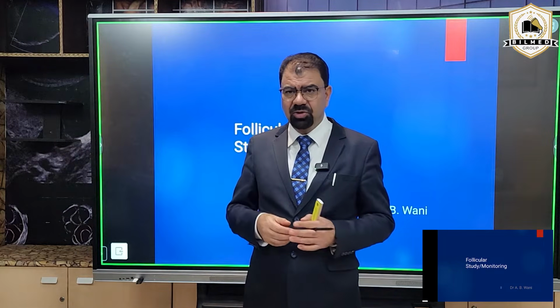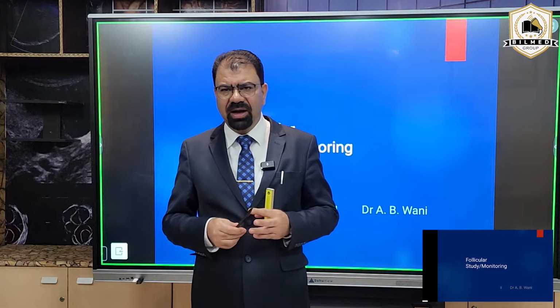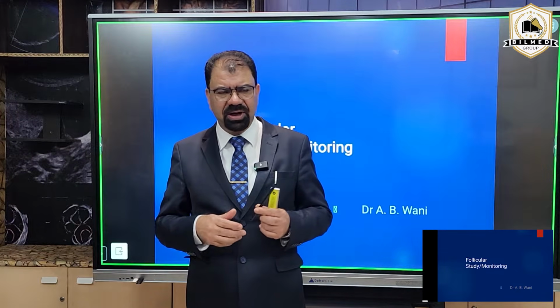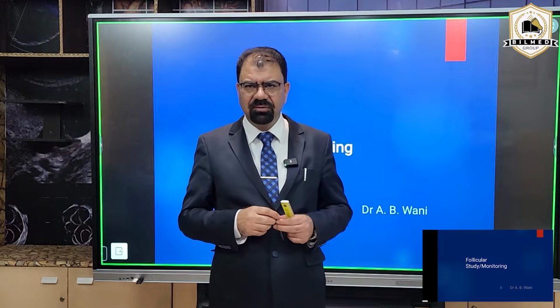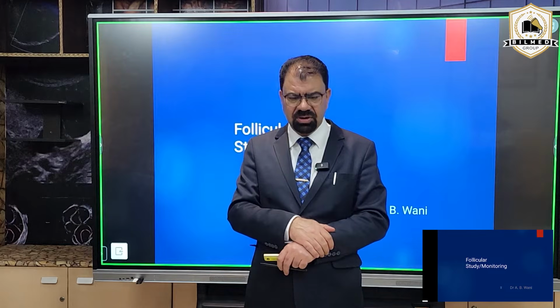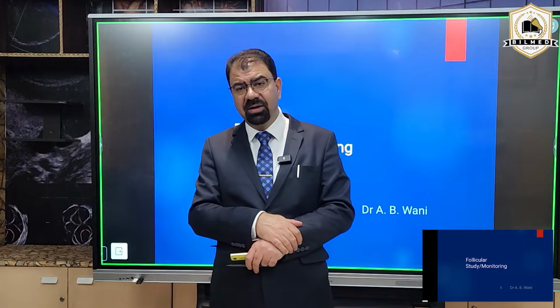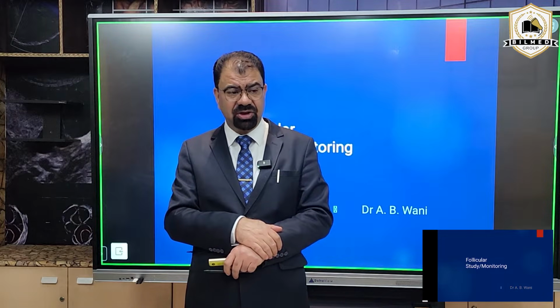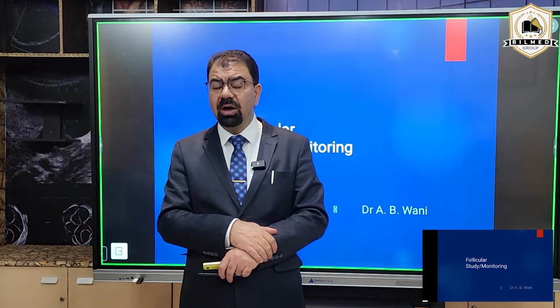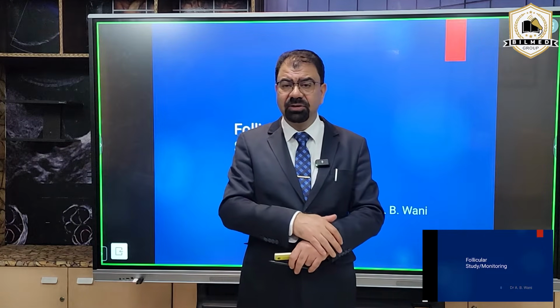Without a stethoscope, we cannot imagine our OPD, and now the trend is changing. Without knowledge of ultrasound, we cannot make a good diagnosis. If you are a gynecologist, it is very, very essential for you to have a basic understanding of ultrasound.